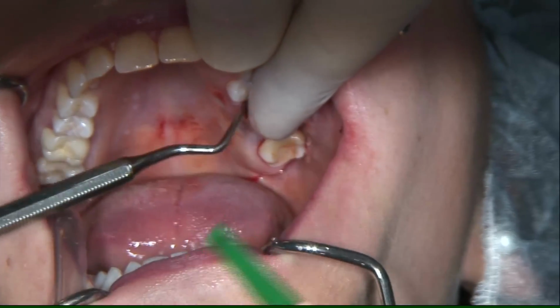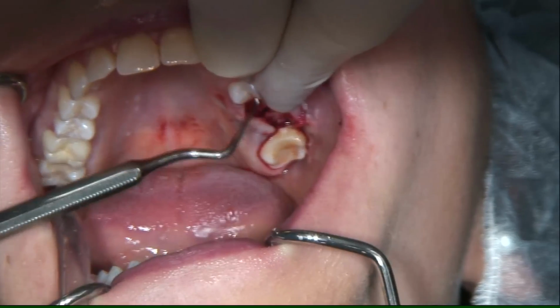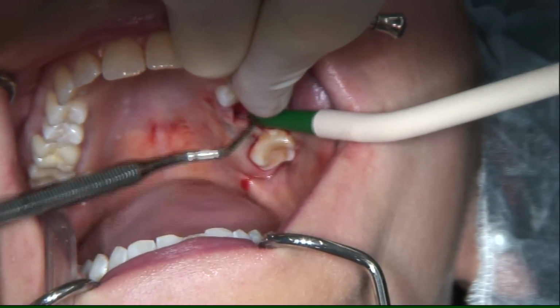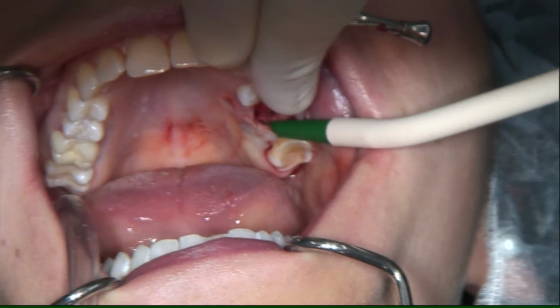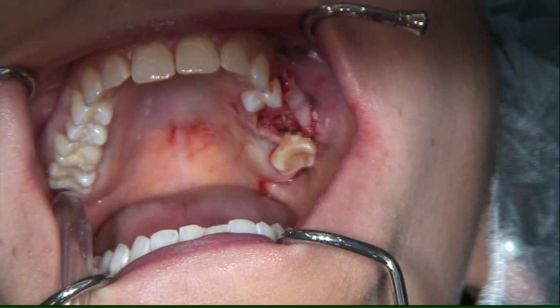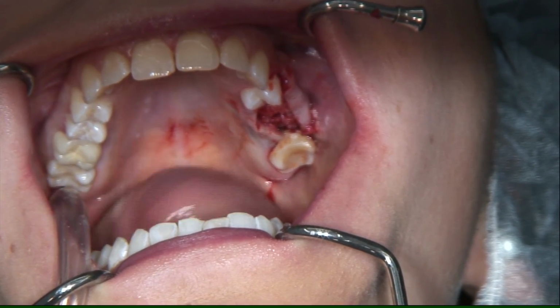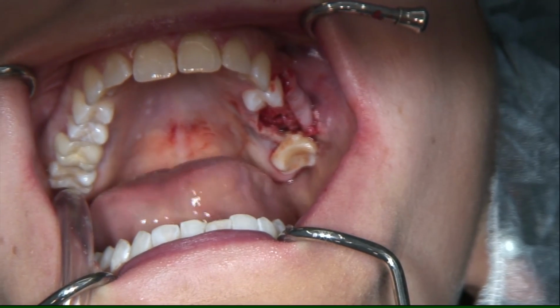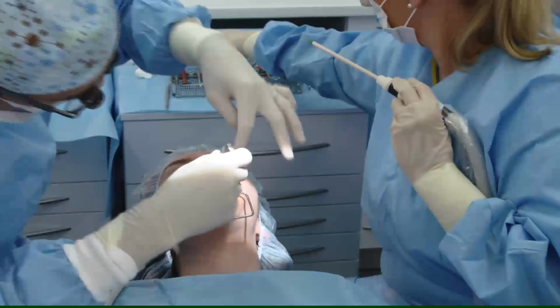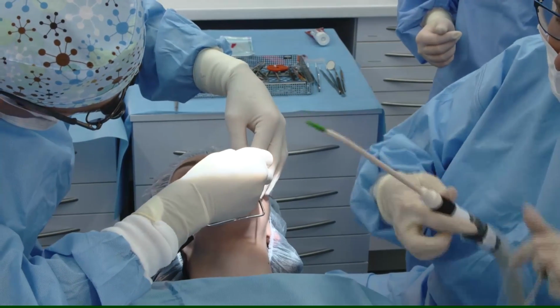The limitations with the SICAT OptiGuide are fully edentulous jaw, so it's recommended to have a partially edentulous jaw, like here. And it's an advantage when we have minor metal artifacts. If we have lots of metal artifacts, we recommend better the classic guide.